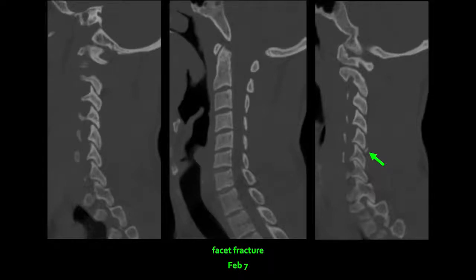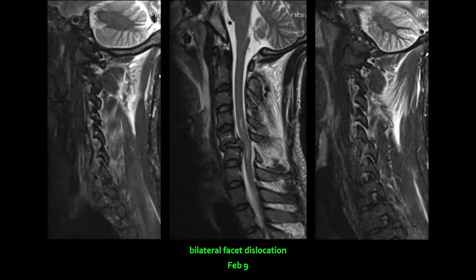What we're missing here is all the soft tissue injury associated with this, and keep in mind that the cervical spine may have sustained tremendous injury with subluxation and distraction of multiple areas that recoil back due to muscle spasm and are then immobilized in a hard collar. So we're seeing potentially just everything is reduced, and the only thing that we can identify is this fracture fragment. So 2 days later, here we go, the patient turned that one little facet tip fracture into bilateral facet dislocations.